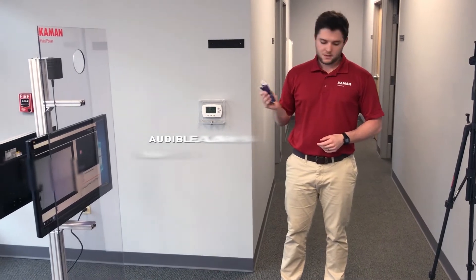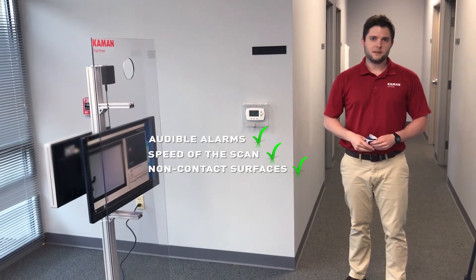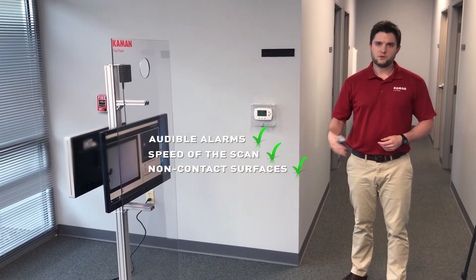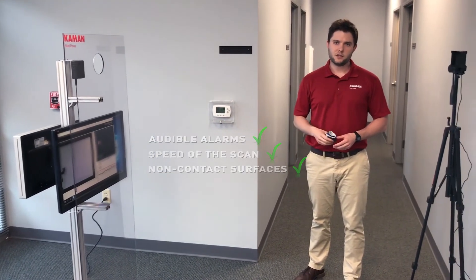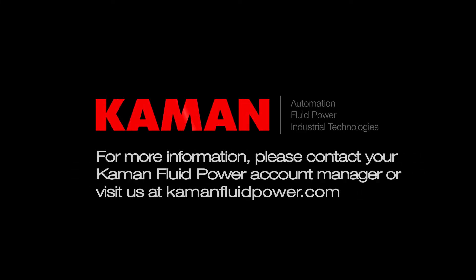The audible alarms, the speed of the scan, and the non-contact surfaces make this the best solution as you start up your manufacturing processes and get back to work. Please call your local Command Fluid Power location for quotes or our FAQ, which will help answer any questions you didn't even know you had. Thank you for your time.